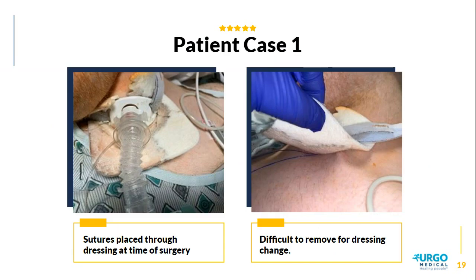So this is our first patient who had the pleasure of receiving this Drawtex tracheostomy dressing at the time of tracheostomy surgery. Prior to the surgery, I had asked the surgeon to actually suture right through that dressing so that we could have it secured in place. However, suturing the dressing to the patient proved to make removal challenging. And as I attempted to cut the dressing away post-operatively, I inadvertently cut the sutures, which thankfully didn't cause any harm to the patient, but nonetheless, we learned from that.